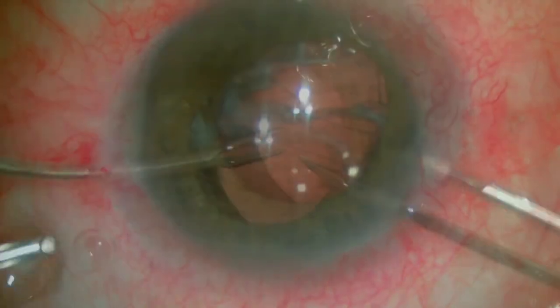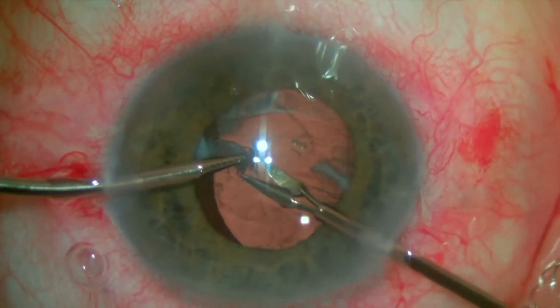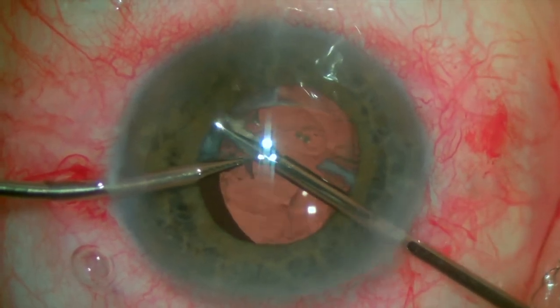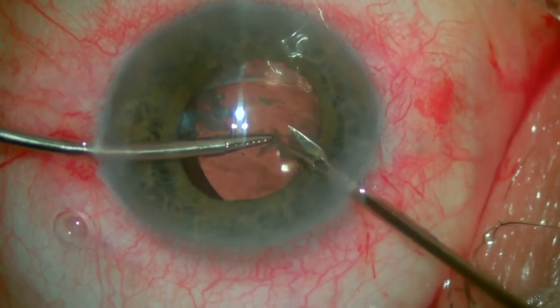So we put some more viscoelastic in the eye and now we take two micro-instruments to help us address this case. We are using the micro-forceps in the left hand to really grab these tissues and present them to the micro-scissors that is being held in the right hand. We carefully cut these fibers to make it easier for the vitrector to work.